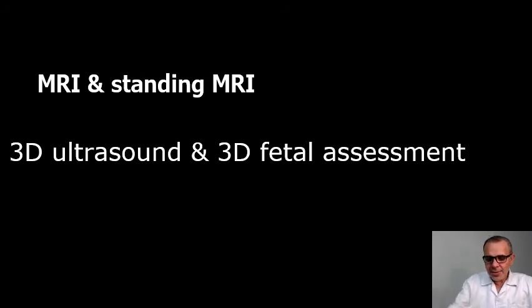But as you all know, the MRI could be a necessity in certain types of congenital malformation, or for example any CNS dysfunction, syringomyelia, any nerves involved. So MRI remains the best alternative for the evaluation of soft tissue and the skeletal system.